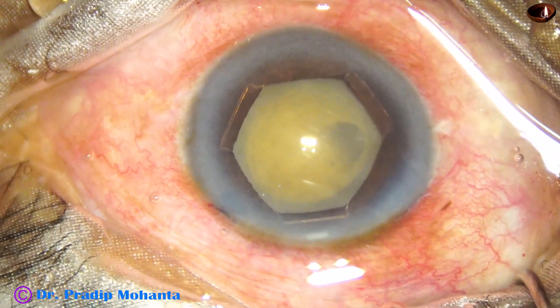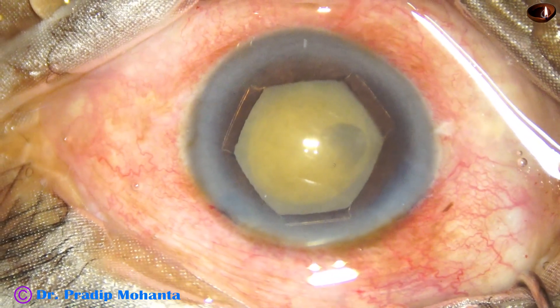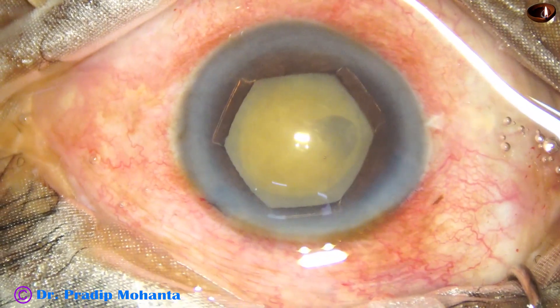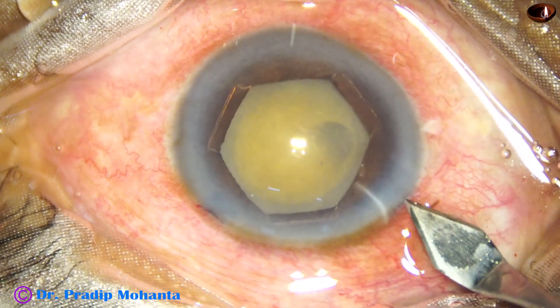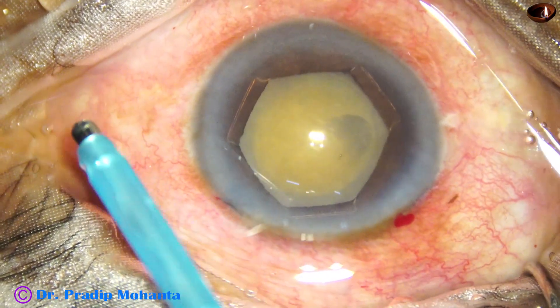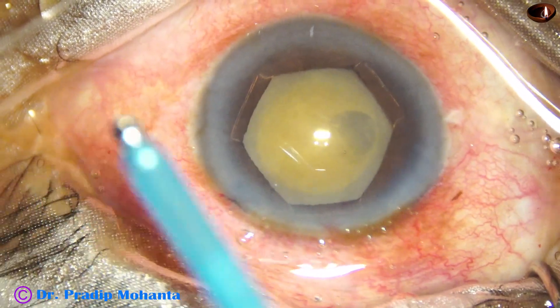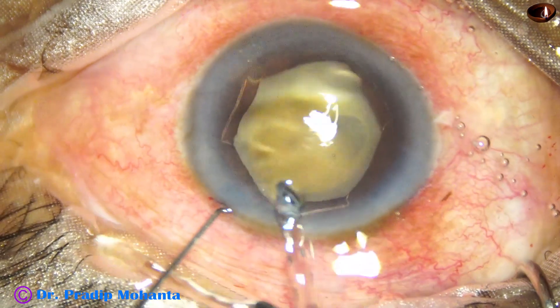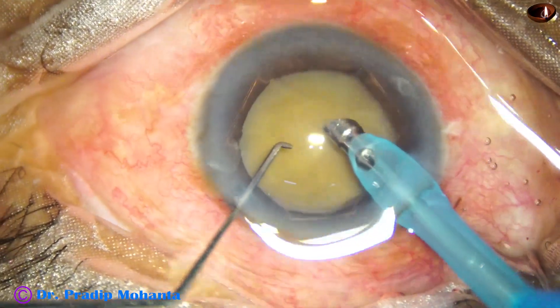This is a small tag of the anterior capsule sticking to the back of the cornea. Now is the time to go into the anterior chamber with the phaco handpiece. I enlarge the main wound just by 0.5 millimeter so that the phaco needle goes in easily and the wound is not stressed.